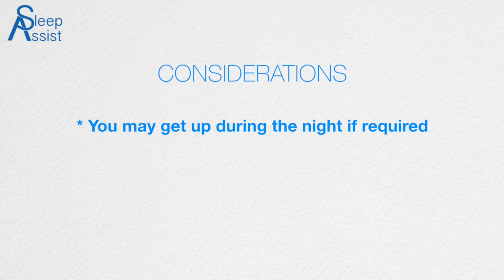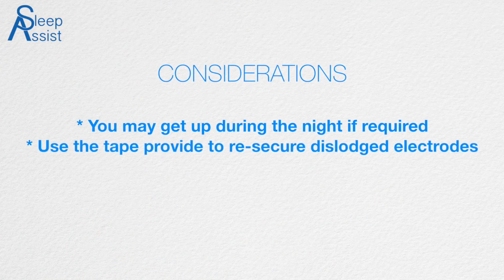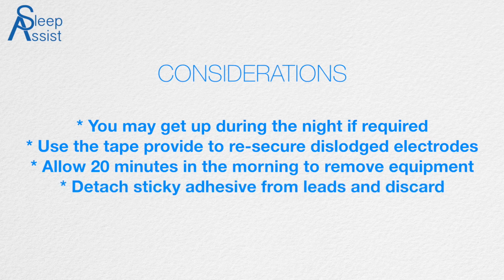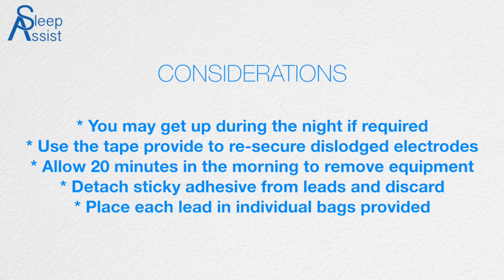You are able to get up during the night if required. Should any electrodes dislodge, use the tape provided to resecure. Please allow 20 minutes in the morning to remove all of the equipment. Detach the sticky adhesive electrodes from the leads and discard. Place each lead in individual bags provided. Thank you very much, and this completes the procedure.